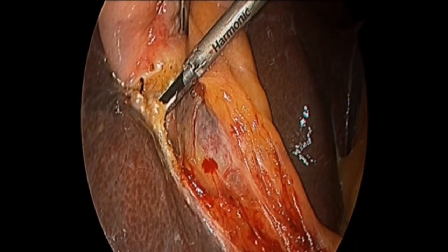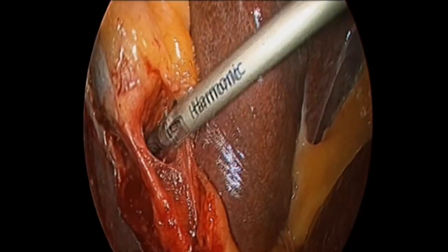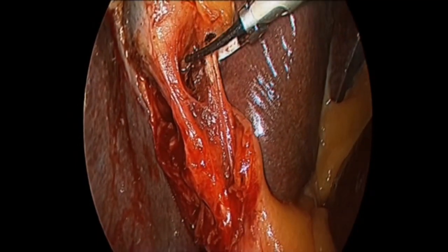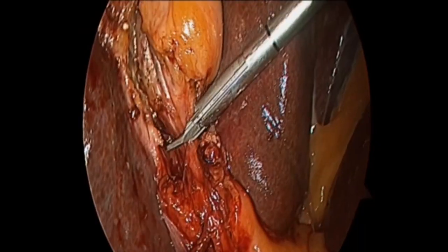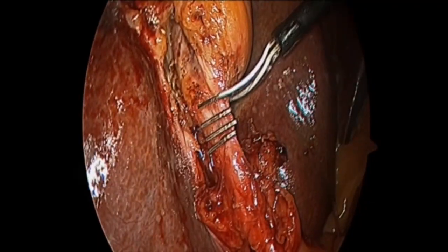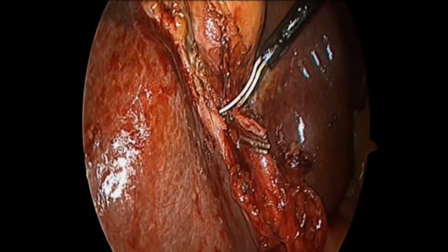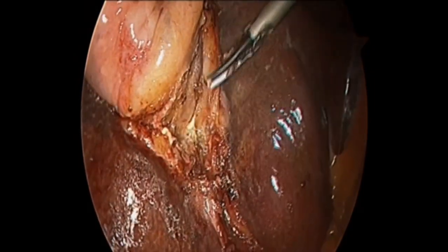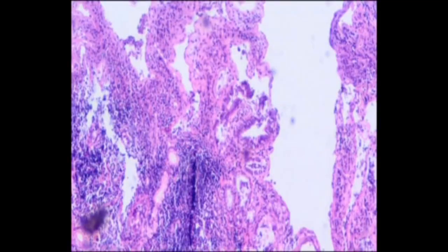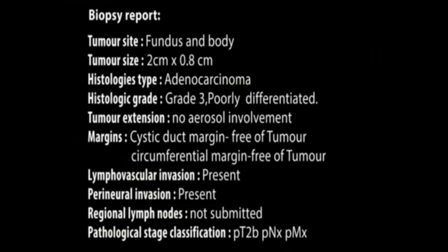Cystic artery and cystic duct were skeletonized before clipping the structures. The cystic artery was taken with the help of Harmonic ACE. The cystic duct was clipped with two clips on the CBD side and one clip on the gallbladder side. The gallbladder was dissected off the cystic plate with the help of Harmonic ACE. The biopsy revealed that the patient had poorly differentiated adenocarcinoma.